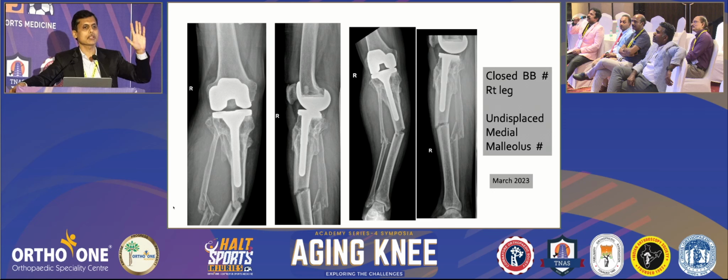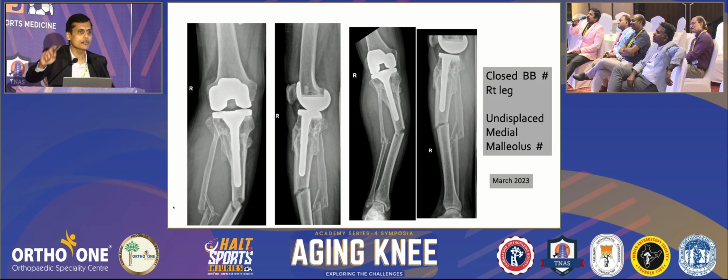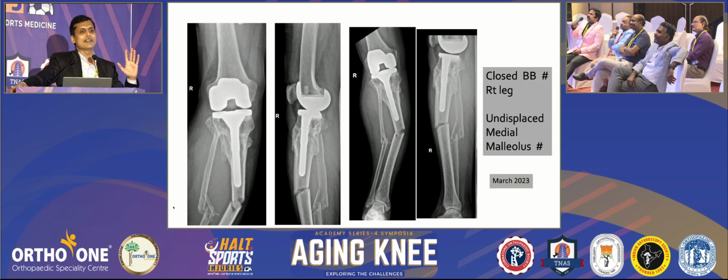What implant do you want to use? I know it needs fixation, obviously it needs a plate. What exactly will be your choice? You choose the best plate to get the best purchase, with maximum screws proximally. A locking plate, yes, you're right. A variable angle locking plate, so that you can get your screws in front and back of the implant, maximum length. For everybody, the information I wanted was whether you are going to use a 4.5 regular DCP or a medial plate or a lateral plate.